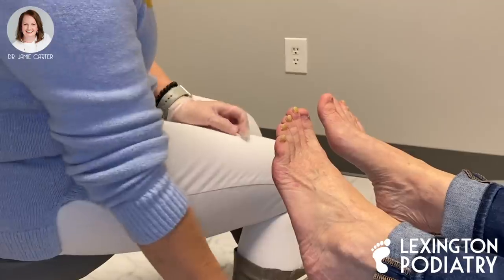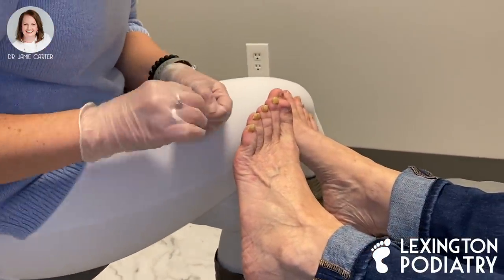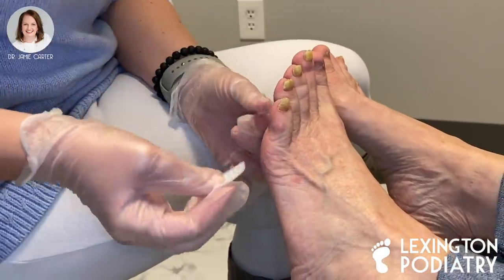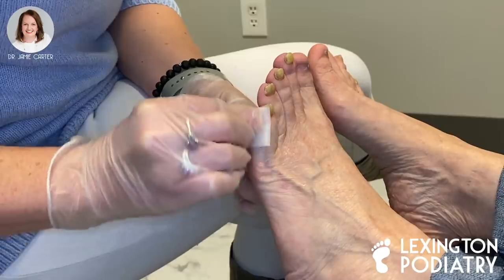Hey, it's Dr. Carter at Lexington Podiatry and today we're going to perform a total permanent avulsion of a fifth toenail. This young lady has been dealing with pain in this toe for quite a while. Her nails are very thick as you can see and it's actually starting to hurt her. The fifth toenail is growing so thick it's obviously hard for her to clip them, so we're going to take care of this toenail.